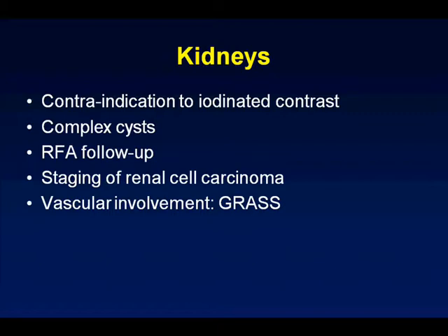Okay, moving on to kidneys. MRI is helpful in patients who are allergic to iodinated contrast. It can help in the evaluation of complex cysts, such as hemorrhagic cysts and RFA follow-up. And I'll show you an example of the complex hemorrhagic cyst, where subtraction imaging can be very helpful to determine if there's any enhancing components.